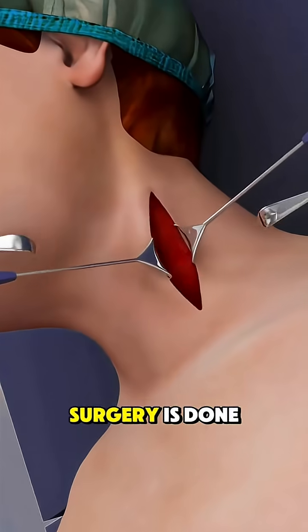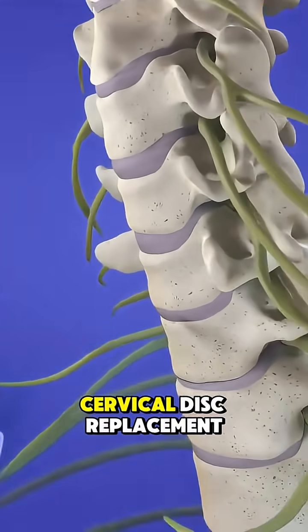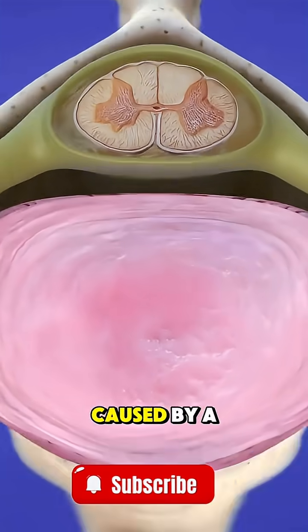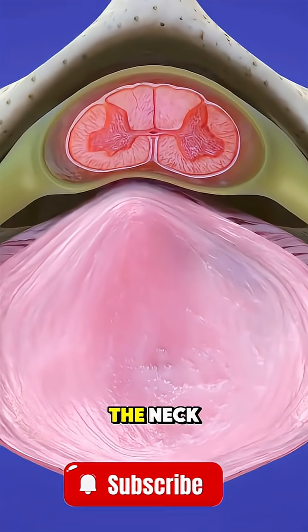Ever wondered how cervical disc replacement surgery is done? Cervical disc replacement is a surgery used to treat neck pain caused by a damaged disc between the bones of the neck.